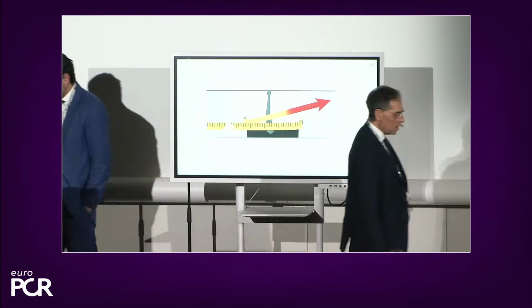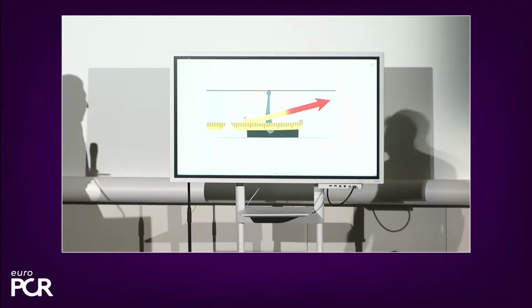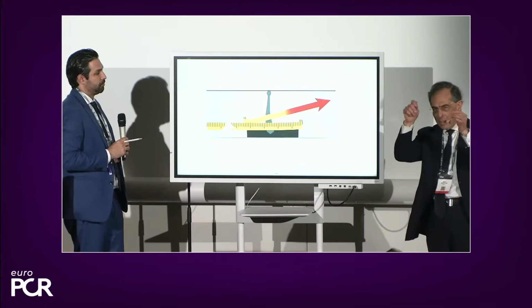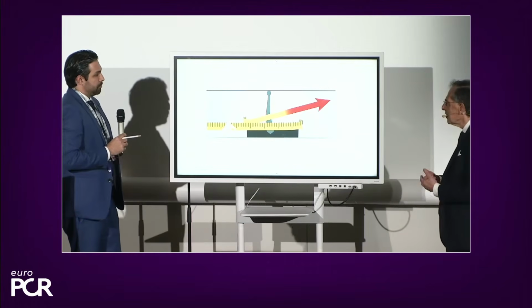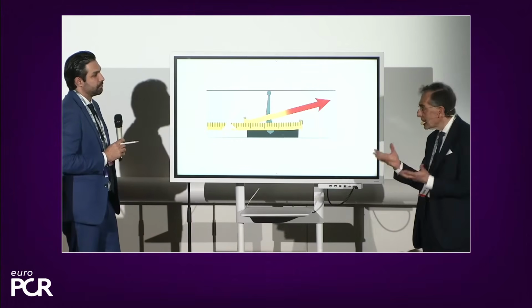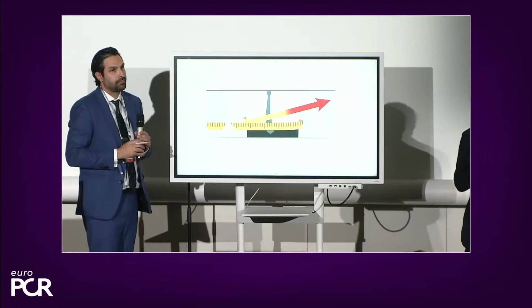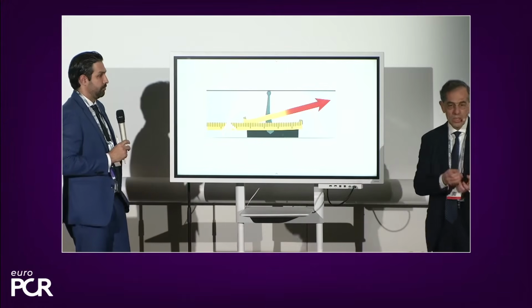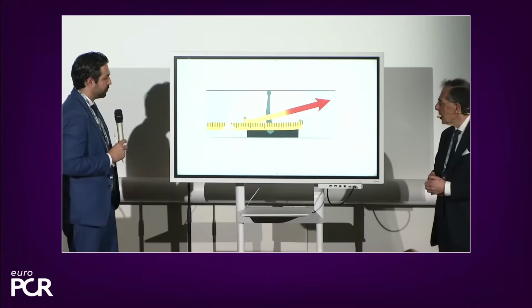BMI, we spoke before, obese patients. What is the limit? You had the magic number of 35. This is something that we also need to collect, in my view, when we are saying that we need to collect the clinical data, we need to prove this technology also for these patients.